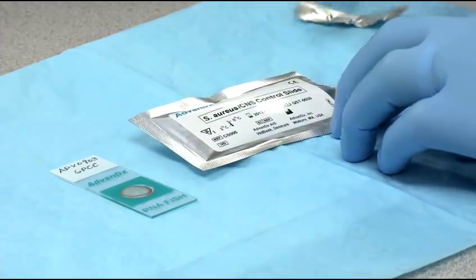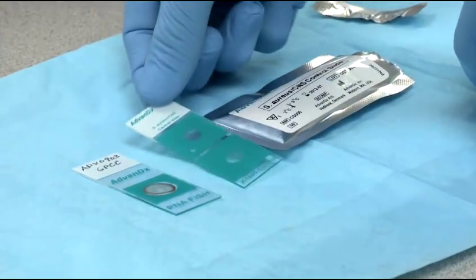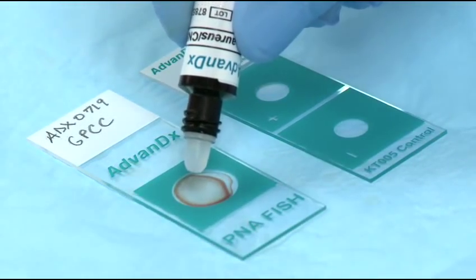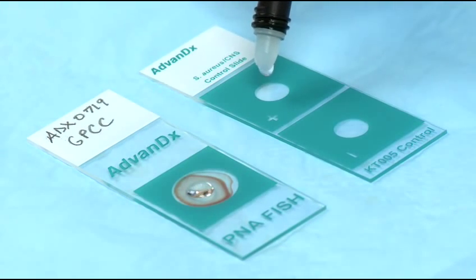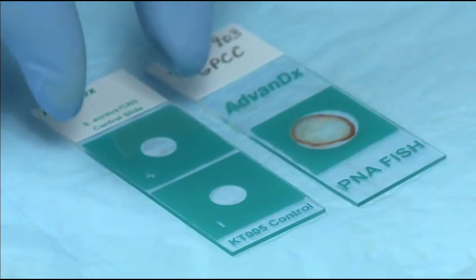Open the control slide for the corresponding PNAFISH test used. Add one drop of PNA probe to each well of the sample and control slides. Add cover slips to each well.